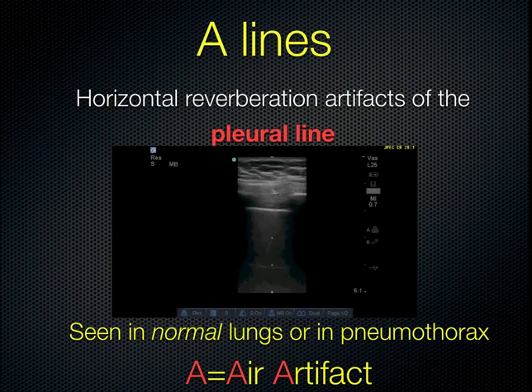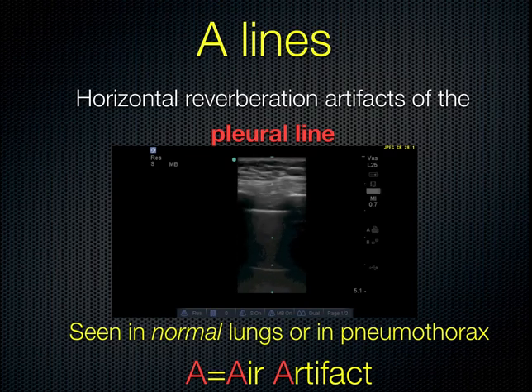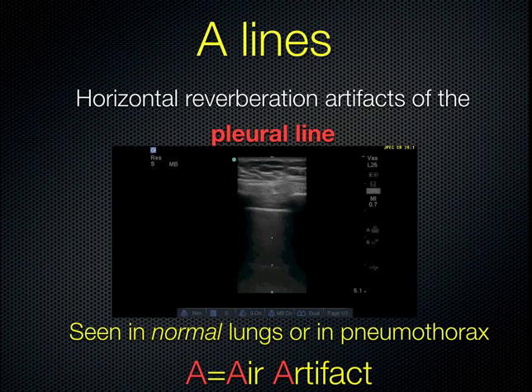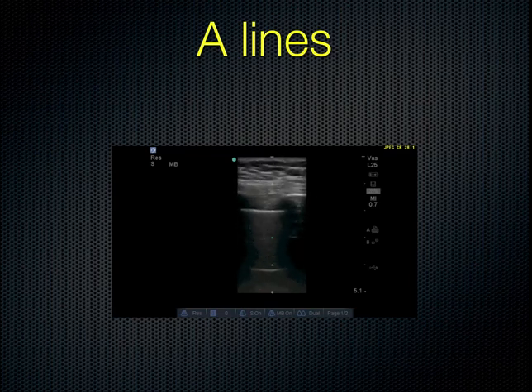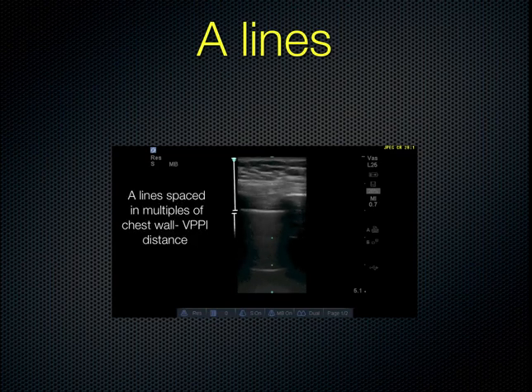With A lines, we are looking at a horizontal reverberation artifact that originates from the pleural line. The ultrasound waves encounter the pleural line, which is adjacent to air — these two adjacent areas with very different acoustical impedances set up an internal reverberation at that interface. Some waves come back to the probe as a reflection off the air in a delayed fashion, and the probe interprets that as a deeper structure. So we see A lines in both normal lungs and in pneumothorax. What we have are two rib shadows, the visceral-parietal pleural interface (VPPI), and an A line which is a reverberation of the VPPI.